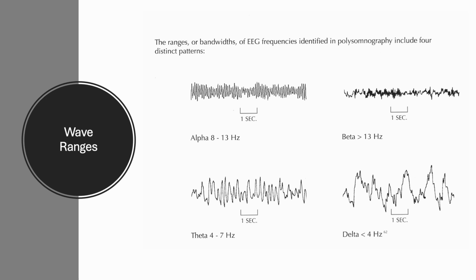Before we talk about the different pediatric waveforms you see, let's refresh on what different waveform ranges are. One way to think about concepts like fast waves or slow waves is to pretend that you had a treadmill fixed with rolls of paper, and when you turn the treadmill on, you put a pin down as that paper moves by and move the pin up and down.